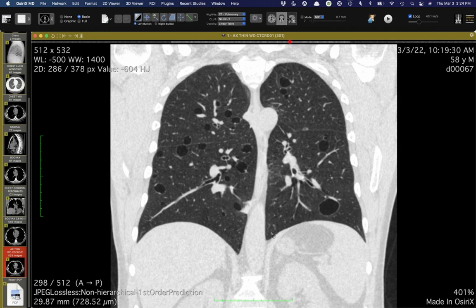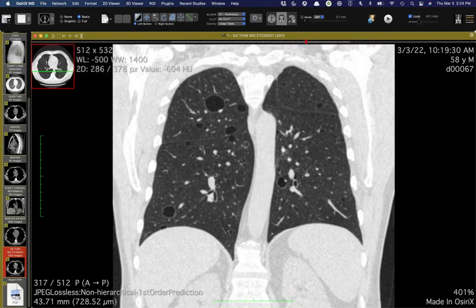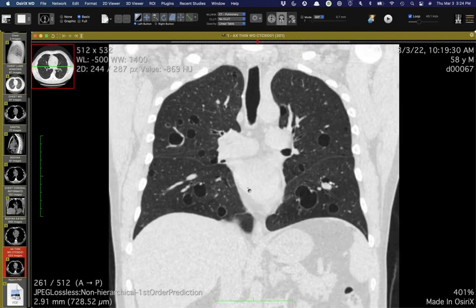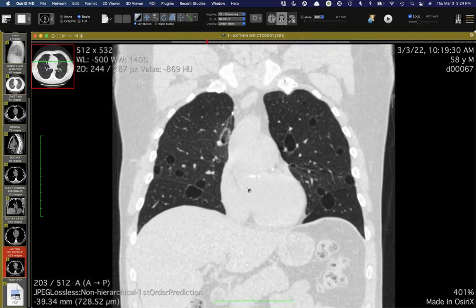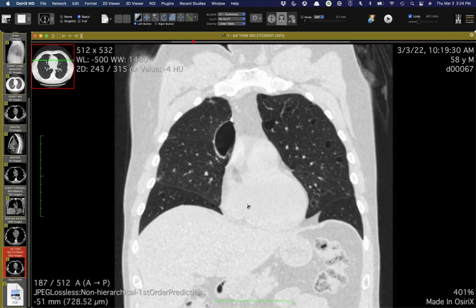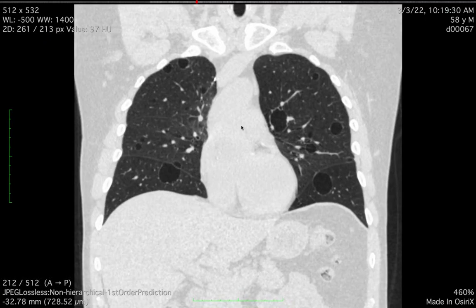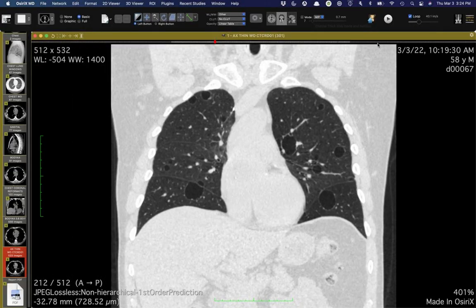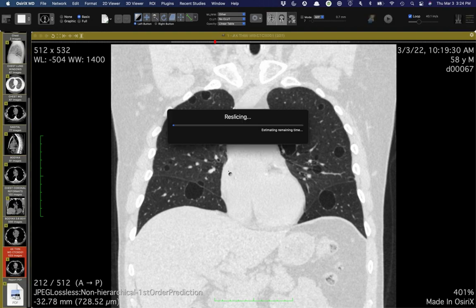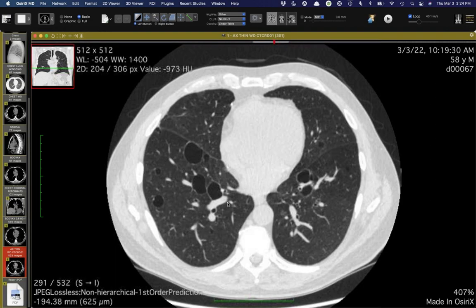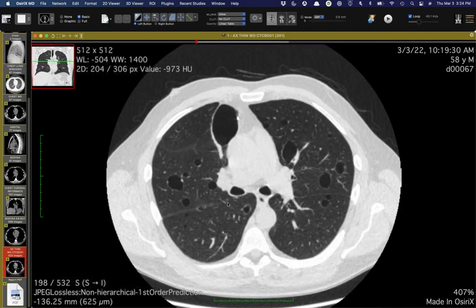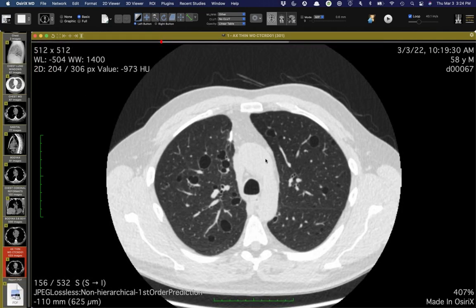Brett Elliker sent me an article where a couple of patients presumptively diagnosed with similar histiocytic disease of the lung ended up having novel mutations in the folliculin gene, thought to be more of a Birt-Hogg-Dubé type thing. These are fairly diffuse — maybe a couple look a little lentiform along the fissures, but it doesn't look like Birt-Hogg-Dubé. And these have been remarkably unchanged for 10 years. Unless the pathologists at Duke and Hopkins are both wrong, we'll go with it.